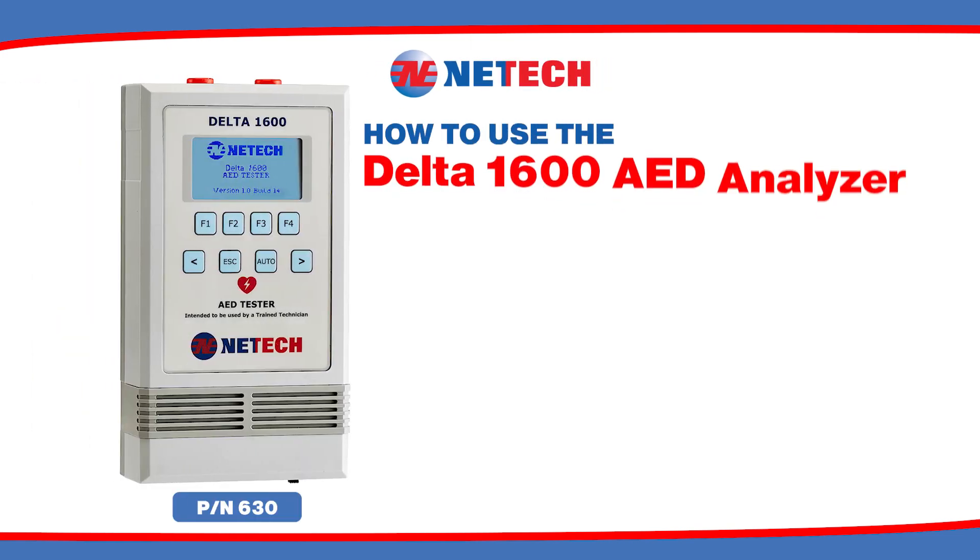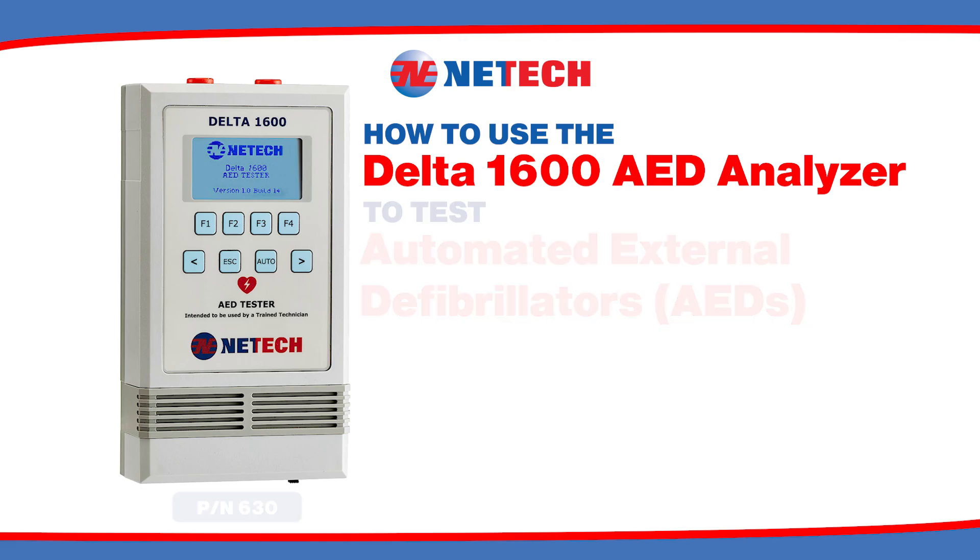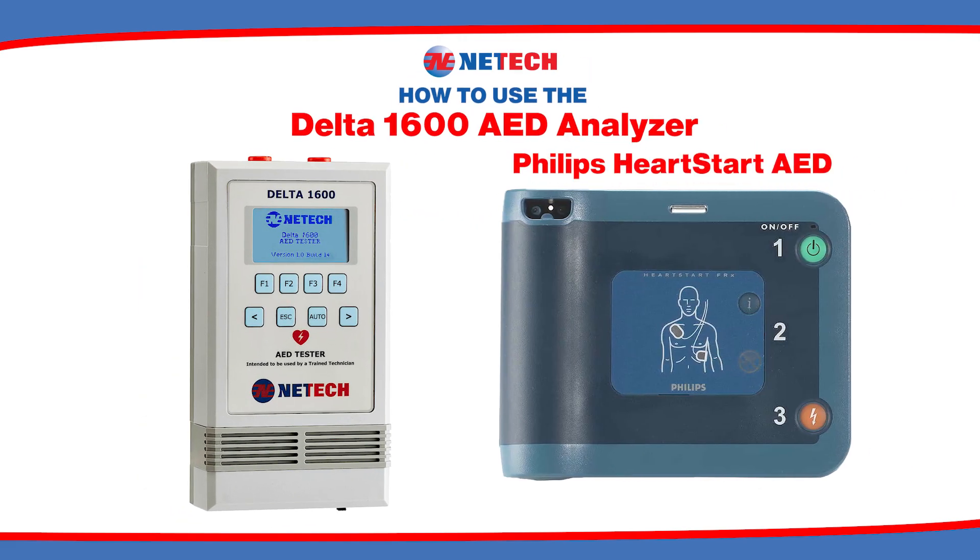How to use the Nettek Biomedical Delta 1600 to test automated external defibrillators. This video will show how to test the Philips Heart Start AED.